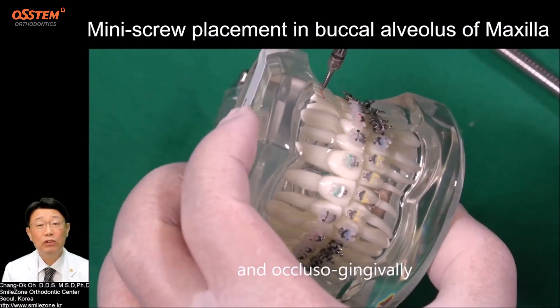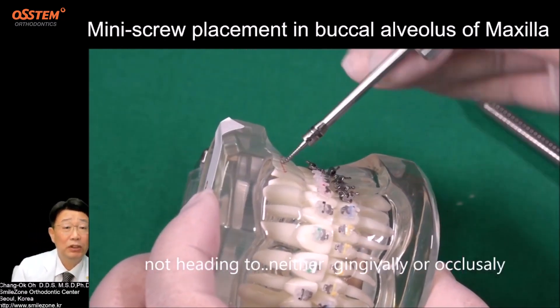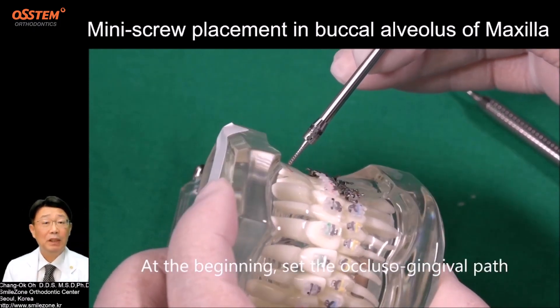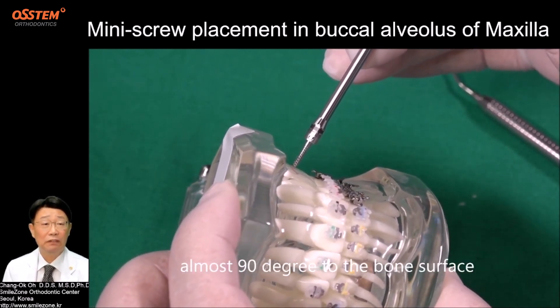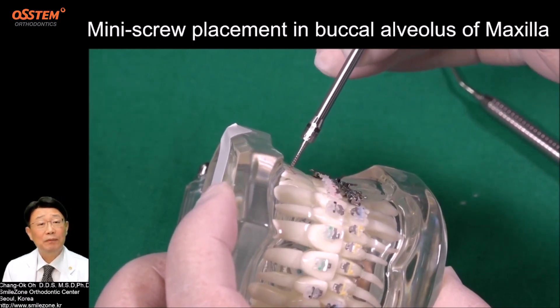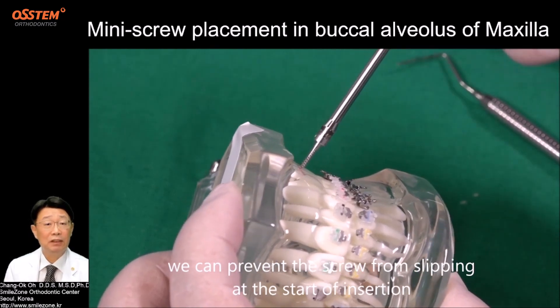Occlusally-gingivally, not heading toward gingival or occlusal. At the beginning, set the occlusal-gingival path almost 90 degrees to the bone surface. By doing so, we can prevent the screw from slipping at the start of insertion.